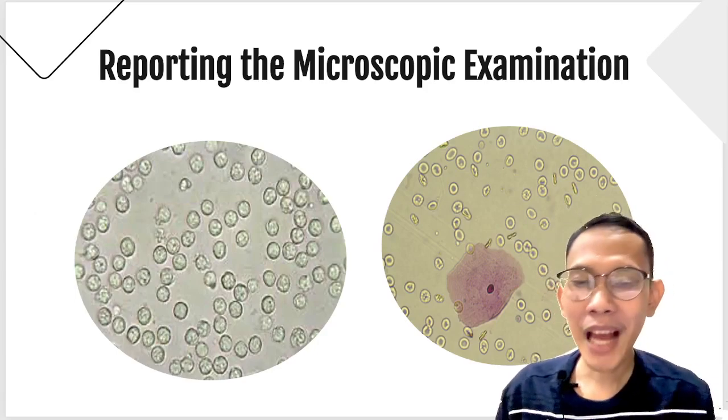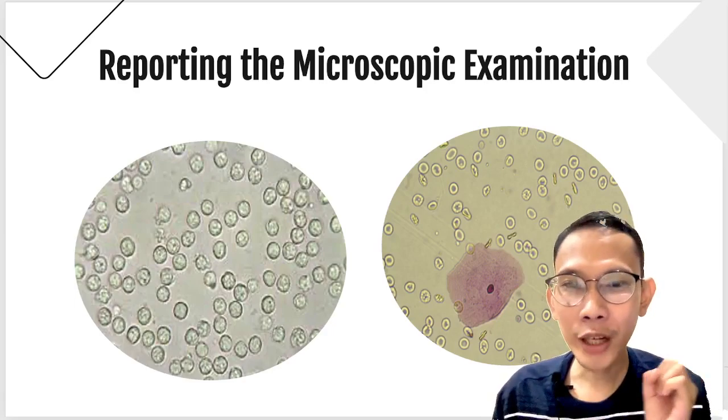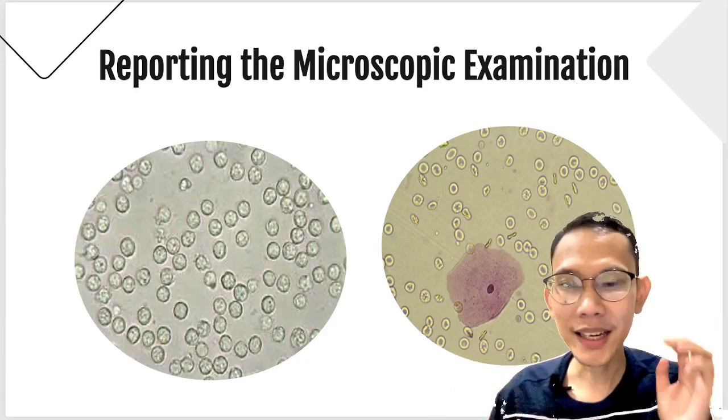Do not worry when we have our limited face-to-face. Hopefully, you can learn and you can see the correct way of the description, anong strategy. Tuturuan ko kayo sa aking strategy. Okay?